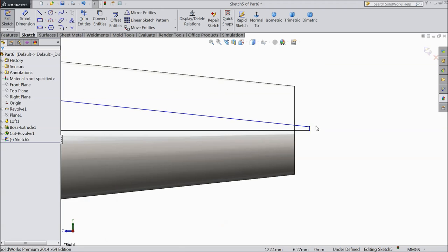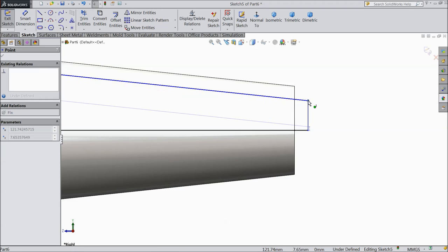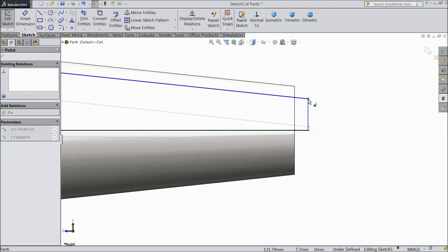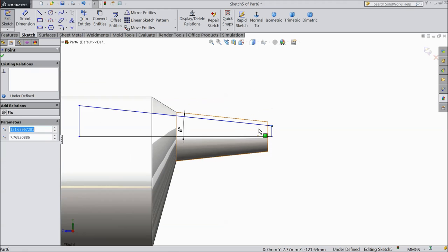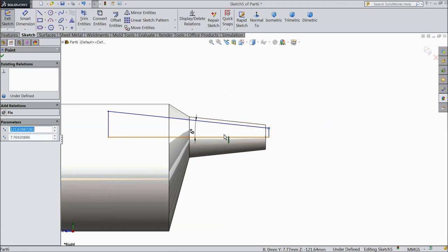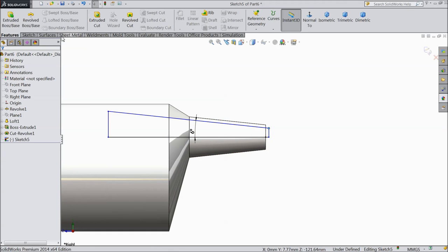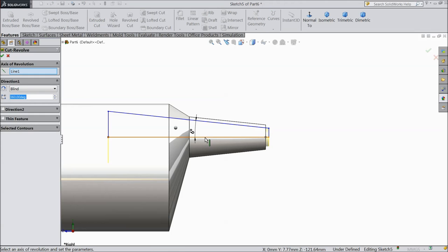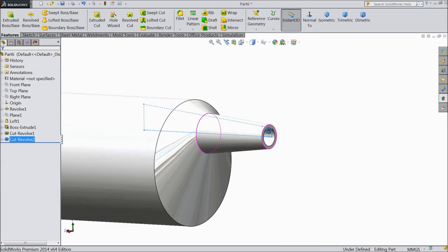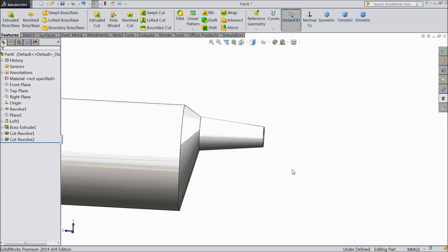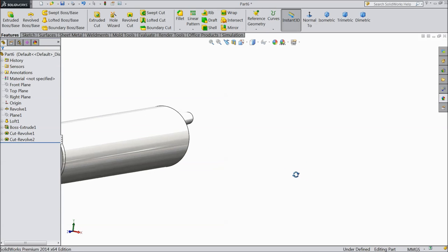Now let's make the gap bigger. Now select revolve cut and select this line as an axis. Now see it is cut. Now see inside.